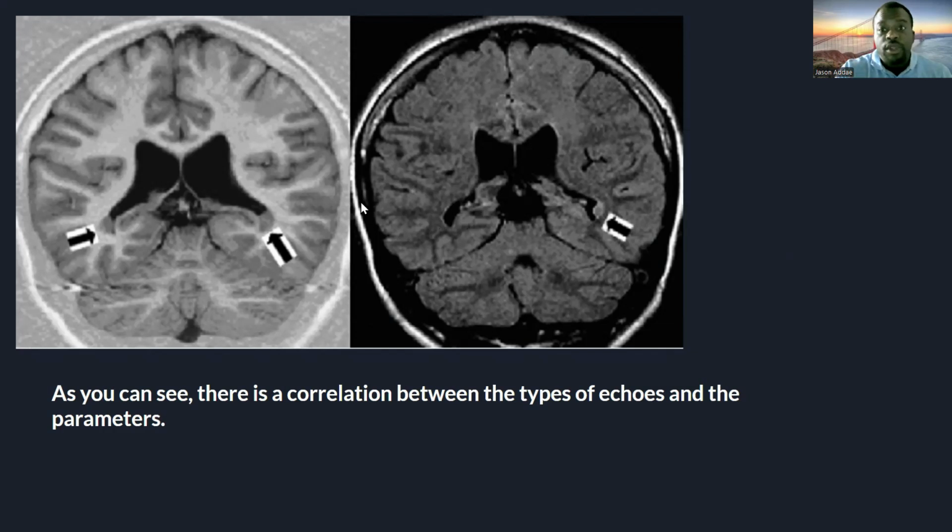So this has inversion, which is another factor. Inversion time, where images can be inverted. There'll be an inversion pulse along that same line that gives you the excitation, that inverts the magnetization. It gives you an image that's actually like a contrast that's used to attenuate fluid or fat, which is useful for pathology as well.